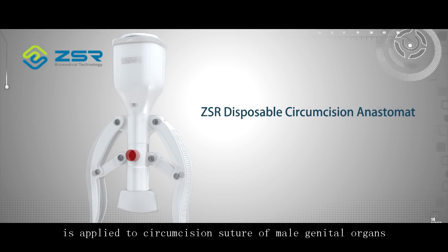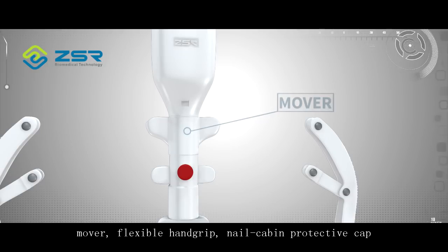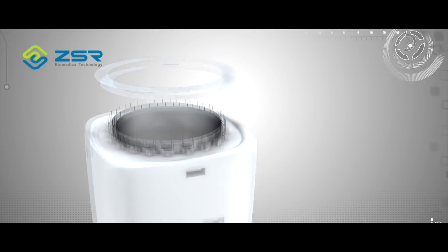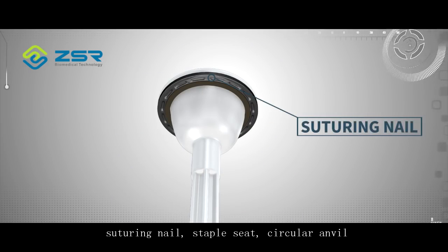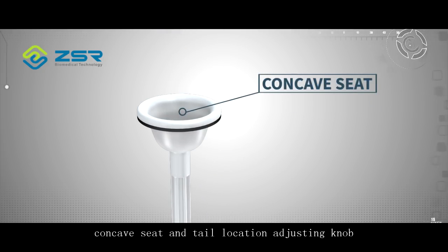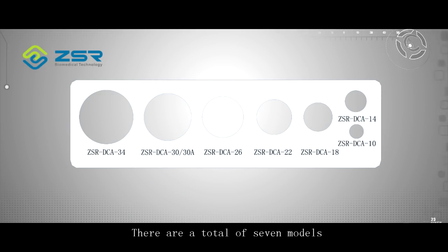The disposable circumcision anastomat is applied to circumcision suture of male genital organs. It is mainly composed of main body cover, mover, flexible hand grip, nail cabin protective cap, gasket, micro slicer, top body, suturing nail, staple seat, circular anvil, concave seat, tail location adjusting knob, and the product also comes with a caliper. There are a total of 7 models.